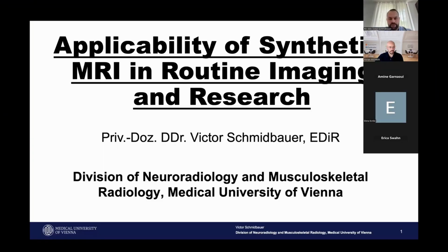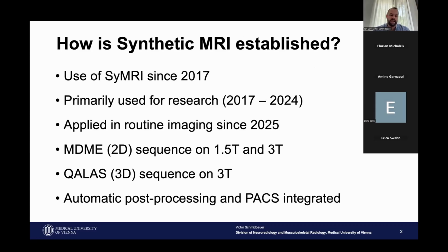Thank you for this invitation and for having me here to talk about the applicability of SyMRI, or synthetic MRI, for routine imaging purposes. This is an area we're going to cover within this presentation, and of course for research purposes. I'm currently working at the Division of Neuroradiology and Musculoskeletal Radiology of the Medical University of Vienna. And we introduced SyMRI in 2017 in our standard protocol for neonatal imaging.